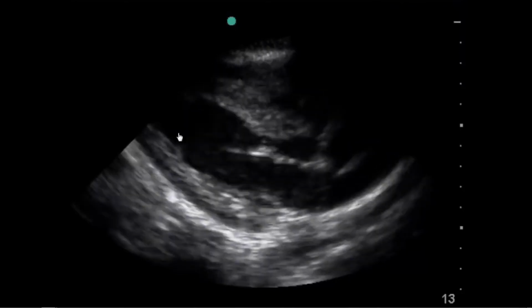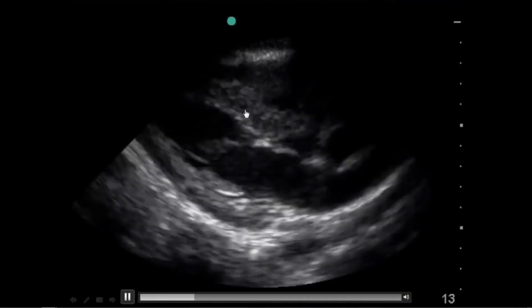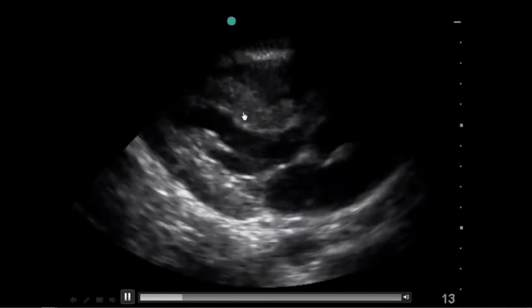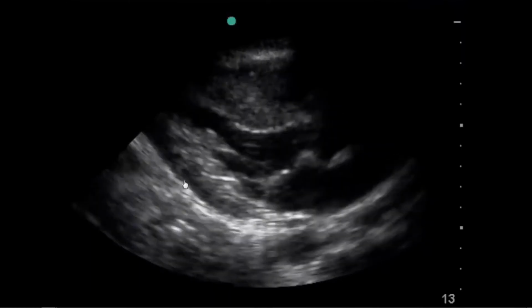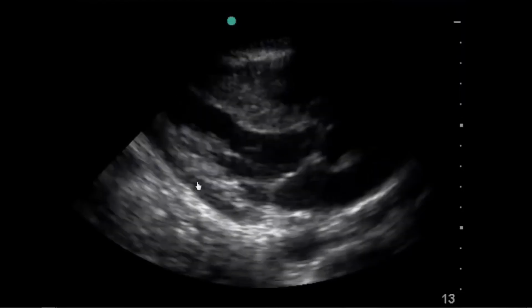The next thing is, is this heart muscle thickening as it contracts? Because there's no difference between septum and bicep or quadriceps muscle in the sense that when it contracts, it should thicken. So we see that every time systole is happening, the muscle is contracting and thickening, and the posterior wall is contracting and thickening. Scar tissue won't do that. So that's another thing to check for.